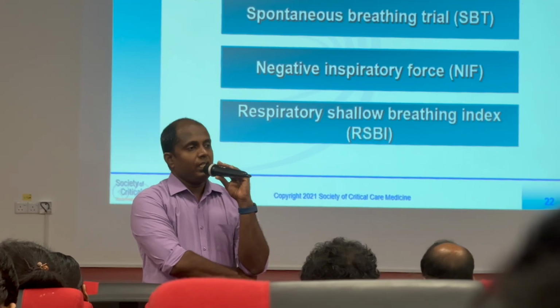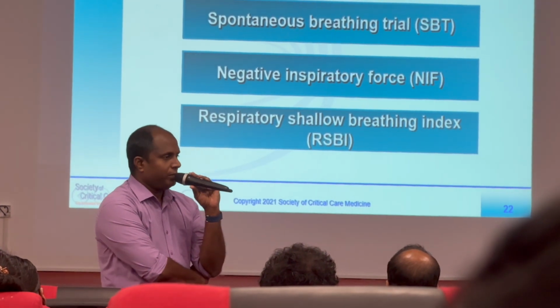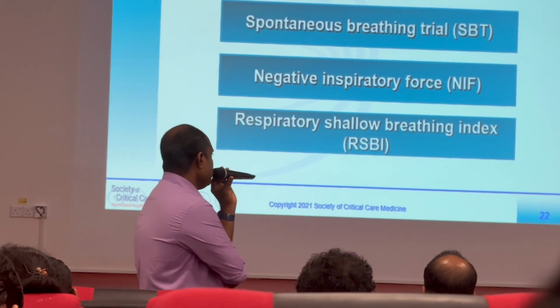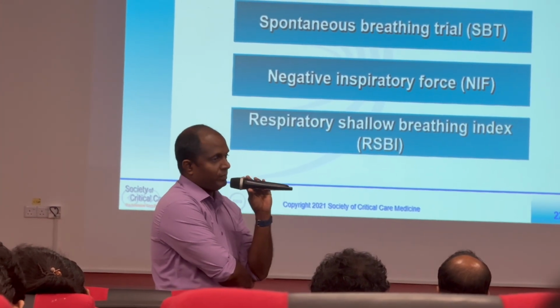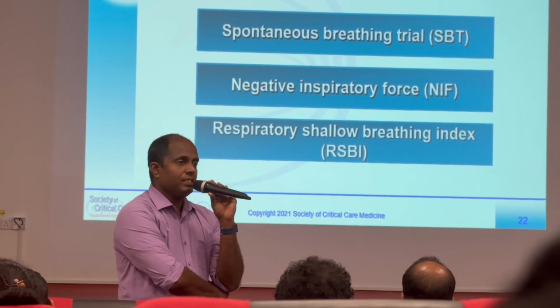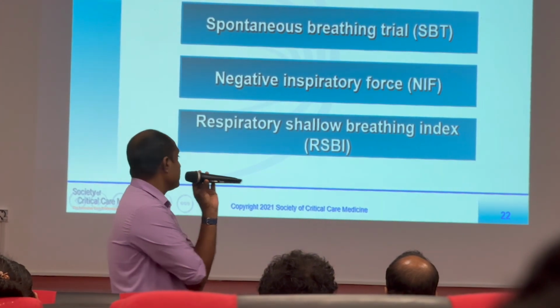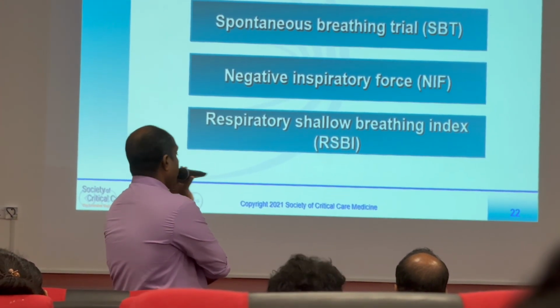But some people will keep that spontaneous breathing trial up to 2 hours. That practice has some issues, but usually we will go for 20 minutes. If failed, then we will put him back on full support and do that again tomorrow, the day after tomorrow, while correcting the things. Negative inspiratory force means what?